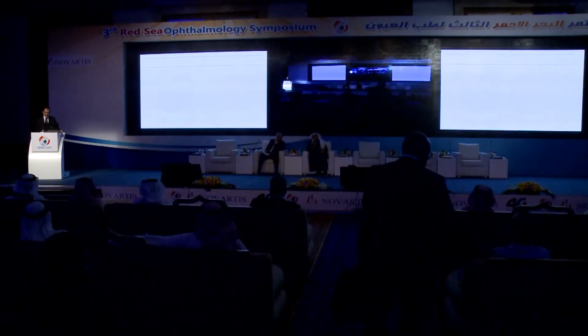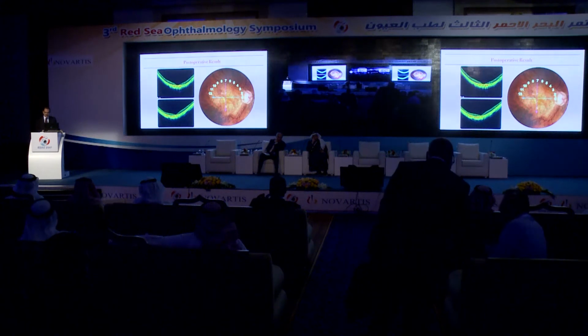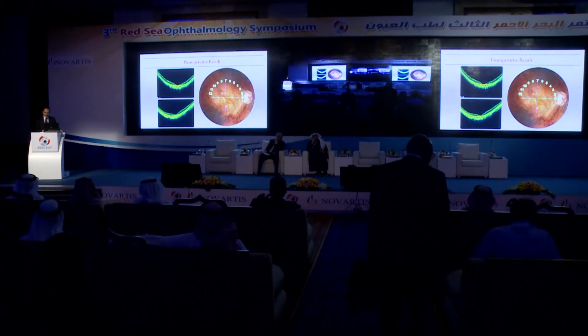What about the results? This is the post-operative result with complete reattachment of the retina and sealing of the macular hole, and in this case, air was only used. This is another case of progressive myopic foveal schisis. This is in 2014 with the macula attached, and the patient has no complaint.